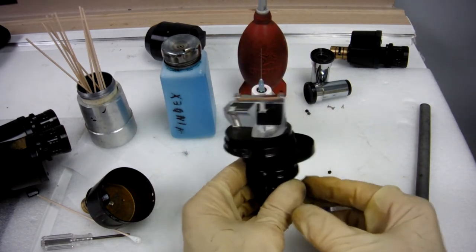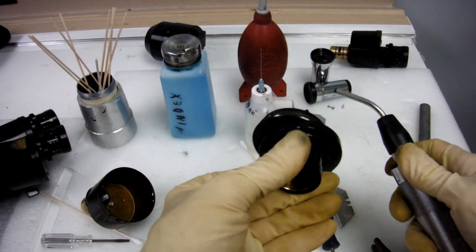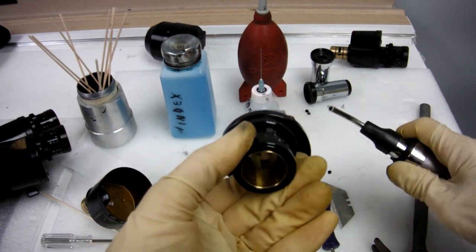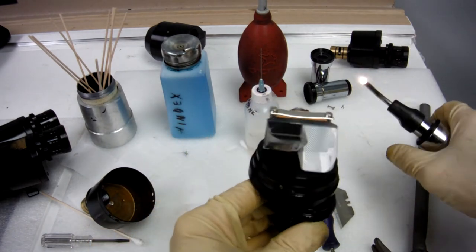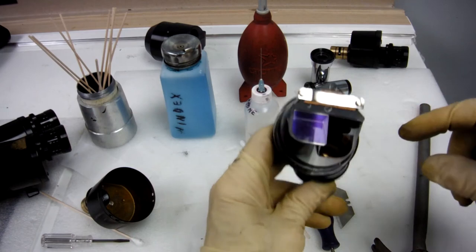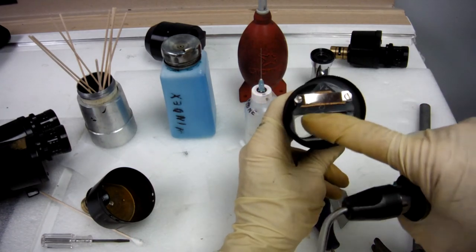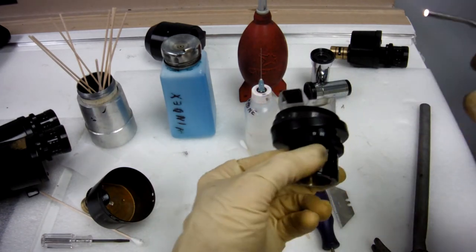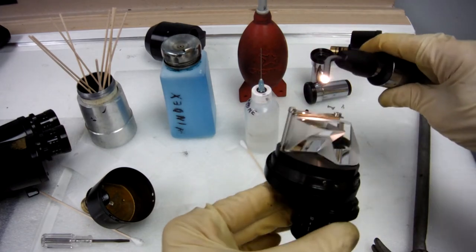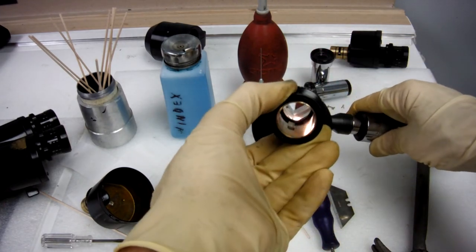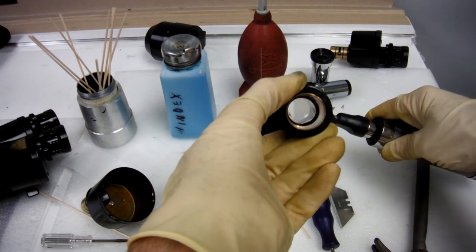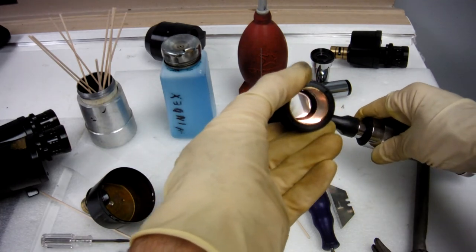When you're cleaning these prisms, using a light source is going to help you. If you point it at this area, it's going to shine through here, and you can check your progress as you're cleaning it.